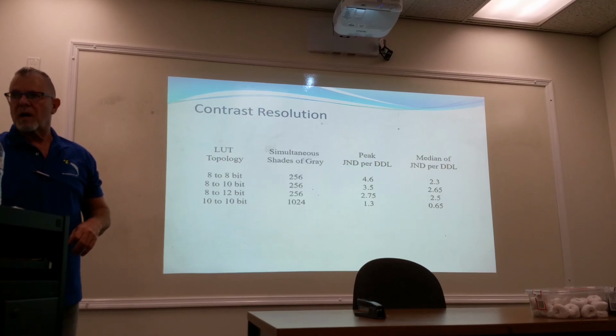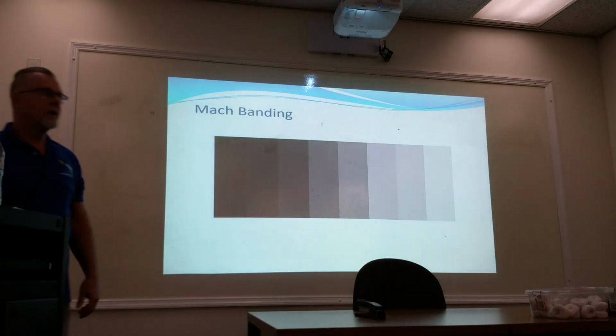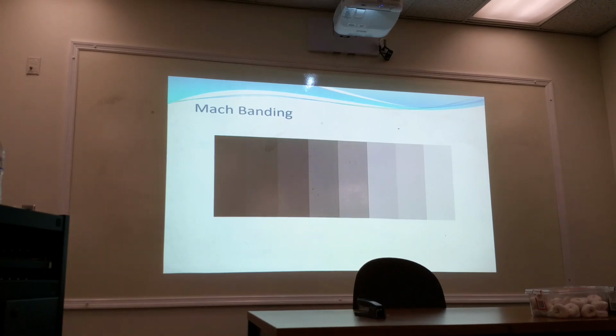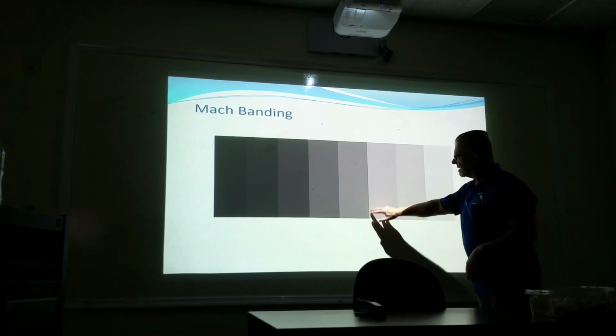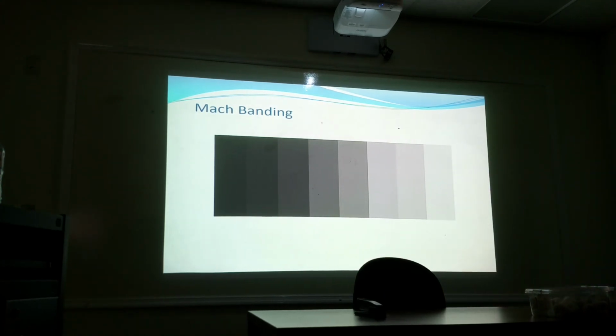I want to get to Mach banding. Everybody should see a lighter line between each one of those grays, right? Everybody see it? Yes. Is it real? No. It's not real at all.